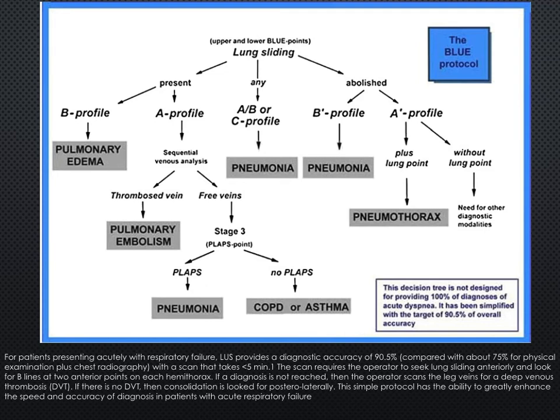So, furthermore, in addition to the systematic exams that we can use for investigation of these lung regions, there are also protocols that we can look to that can give us some guidance on interpretation of some of the findings that we're going to find within our exams. So, probably one of the best known protocols for undertaking a systematic exam for lung ultrasound is the Blue protocol by Daniel Lichtenstein, who, if you don't know who he is, he's probably one of the most important players in the development of lung ultrasound.